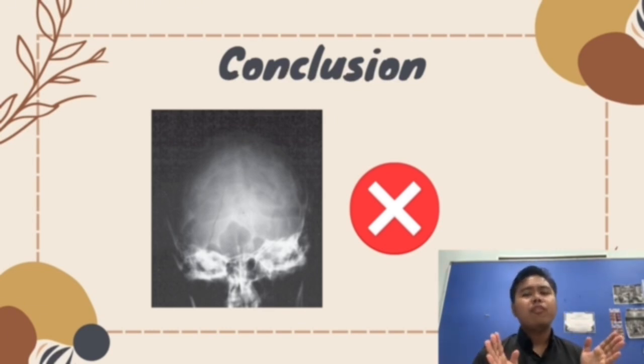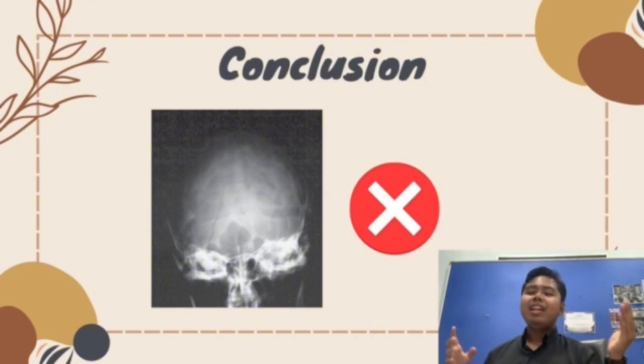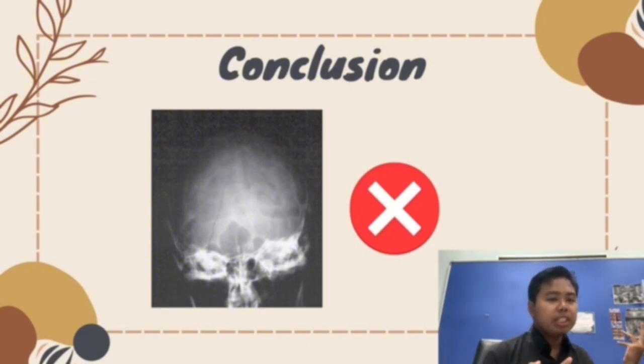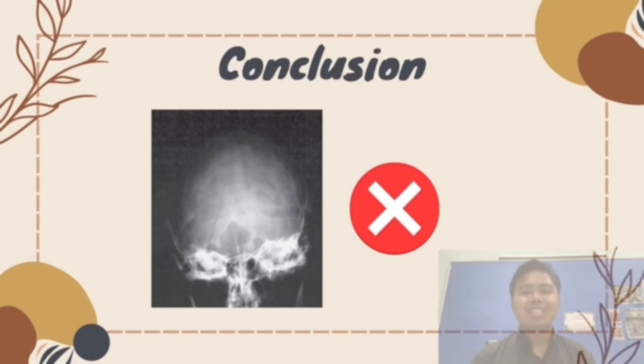Because the radiograph doesn't have a left or right marker, we and the doctor don't know which side is the left or the right side. Other than that, the radiograph also doesn't have the patient's name, patient's ID or hospital name. It makes the radiograph incomplete, so we won't know whose radiograph it is. It could be another patient that came to the hospital. So that's all from me, and we will move to my friend Haiqal to explain more about his projection.